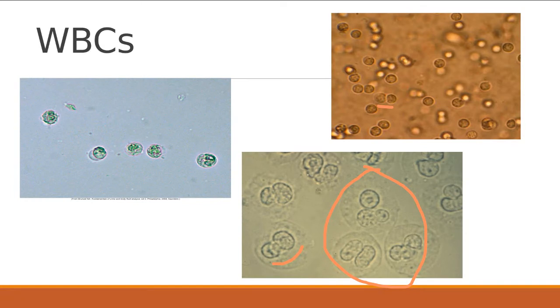They can disintegrate as they age. So go back and look at refrigeration and stability of urines from the first part, module 1, I think, and you'll be able to see how things change. So just the changing of pH, or any of it, but pH plays a really big part of it. Any type of improper storage is going to cause problems with everything, microscopic and chemical wise. Okay, well, almost everything. They'll swell or lyse in a hypotonic solution, and then they'll get smaller in a hypertonic. In a hypertonic one, because they're smaller, it could be easy to mistake those for red blood cells. But once again, you go back and look at the chemical strip, what you got for those results, and does it match what you're seeing under the scope?